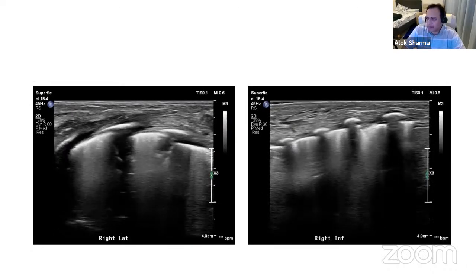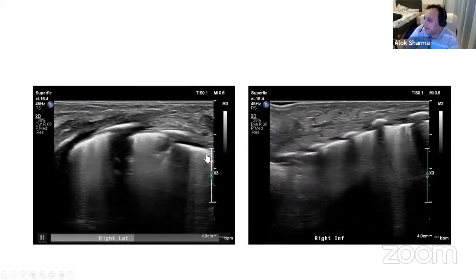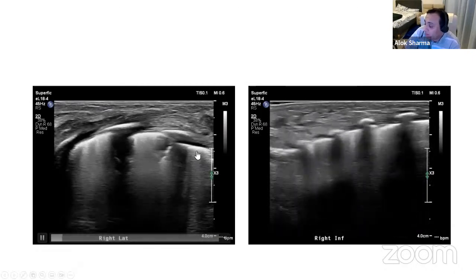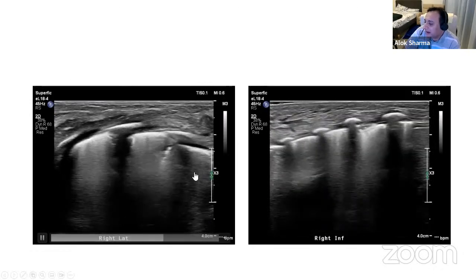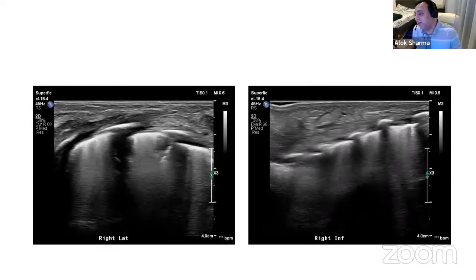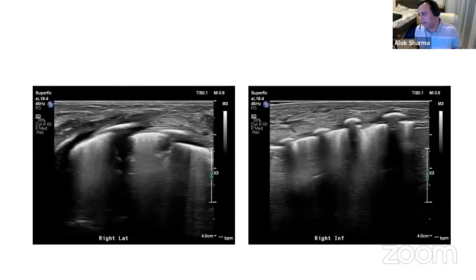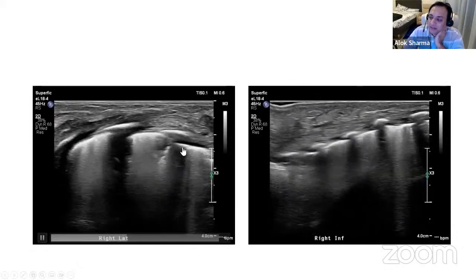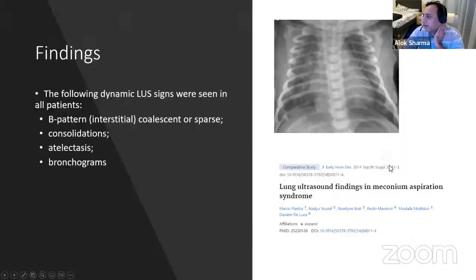But yes, for the perfectionist amongst us, I would not worry from my perspective if you had the focus at the level of the pleura, and then brought it down when you wanted to see the consolidation. But by keeping my focus at that level, I mean, also just for your knowledge, I've taken about 35 images on this baby, but what I'm showing you is actually just a handful. There are images where I've looked at the pleura with the focus at that margin, but really to optimize this image to show you the consolidation, I've got my focus at the appropriate level.